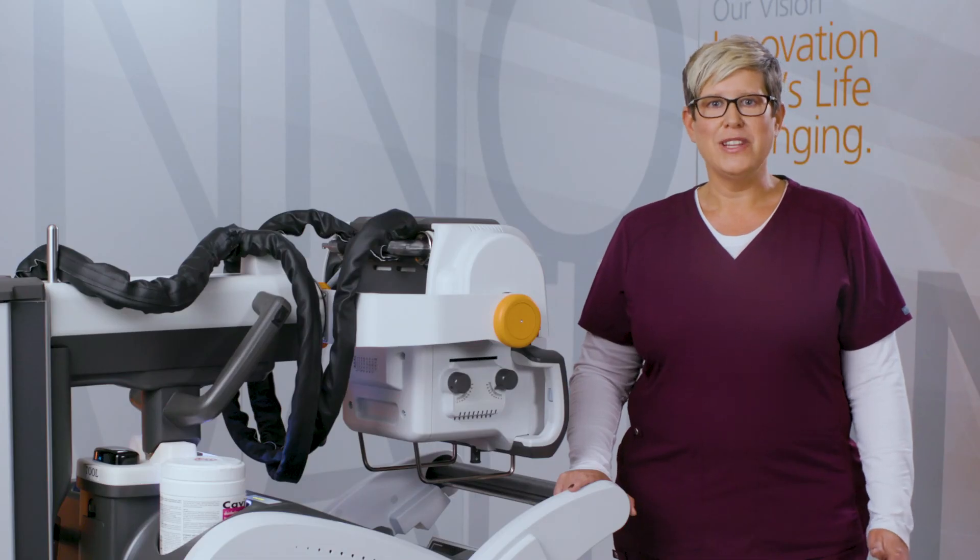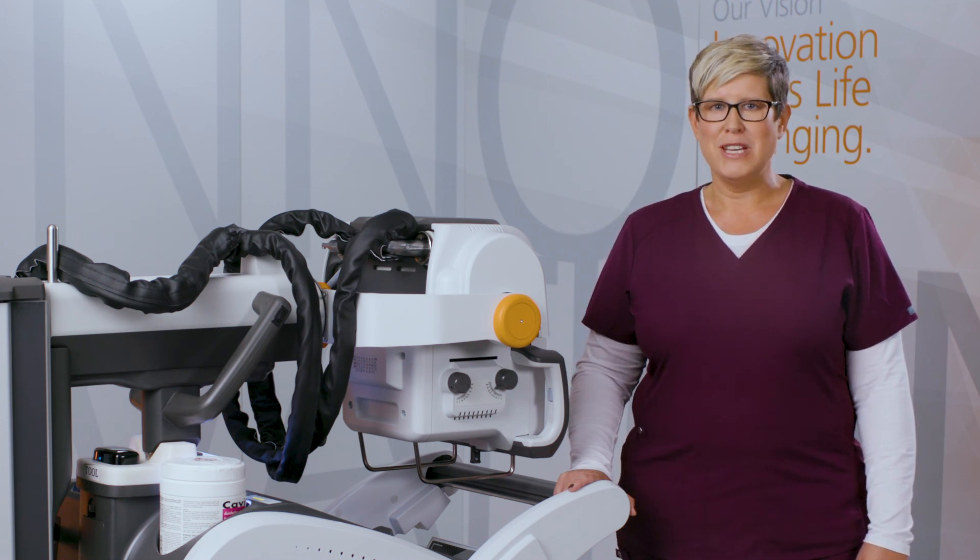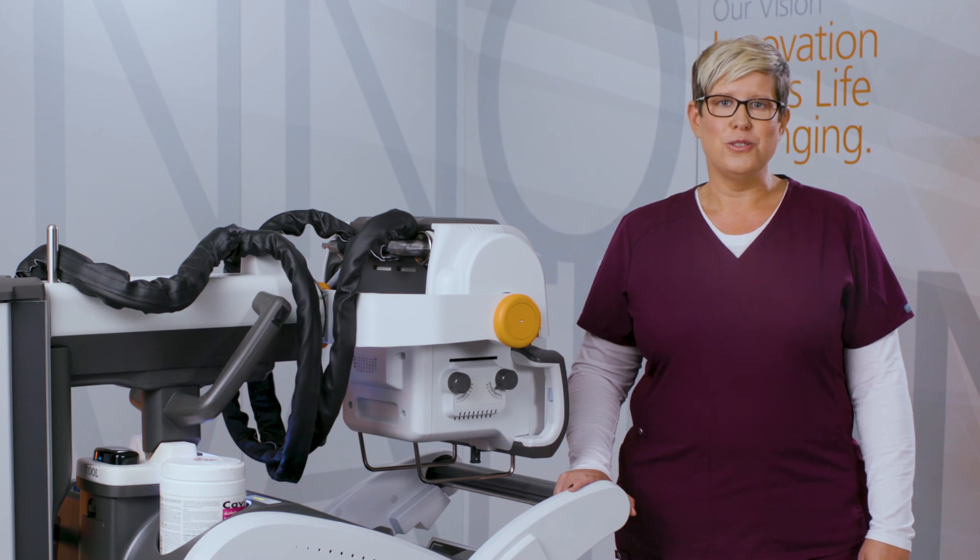I hope you've enjoyed learning about the CareStream DRX Revolution mobile x-ray system. For more information, contact your local CareStream sales representative.